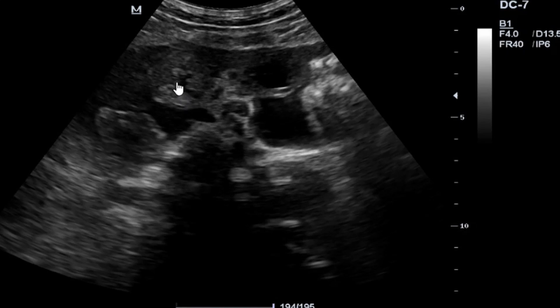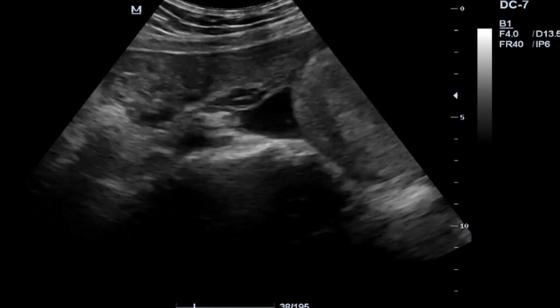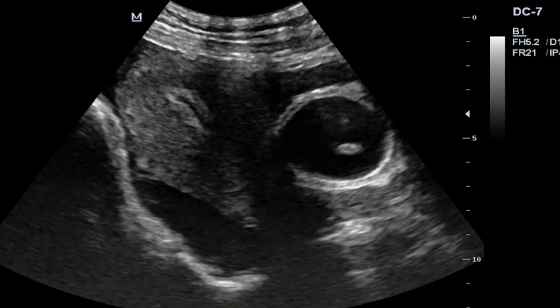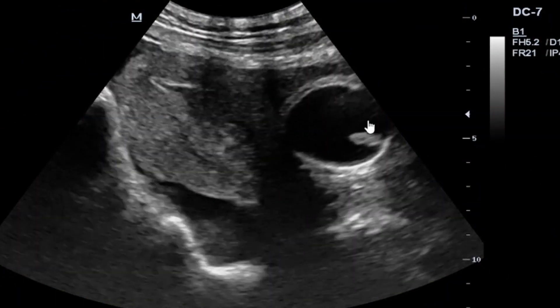This looks like the umbilical vessels — this looks like an umbilical vein here. This looks like part of the fetal abdomen, and right around you can appreciate the free fluid, which is consistent with the rupture. Again, appreciating from this end, you can see our catheter bulb is in situ and inflated.